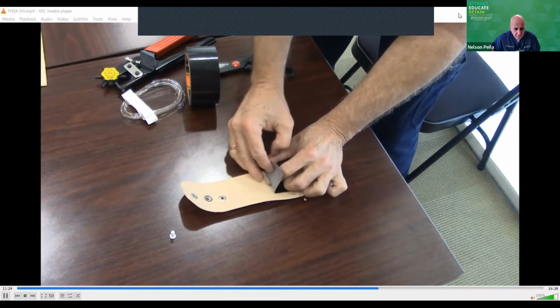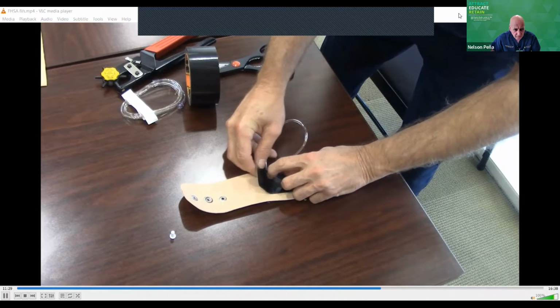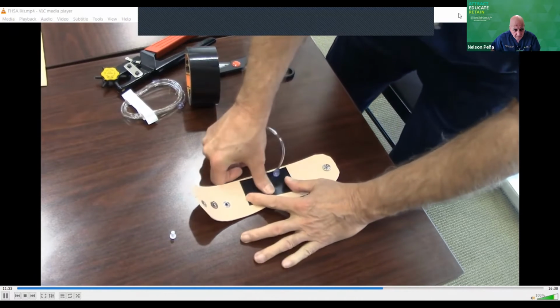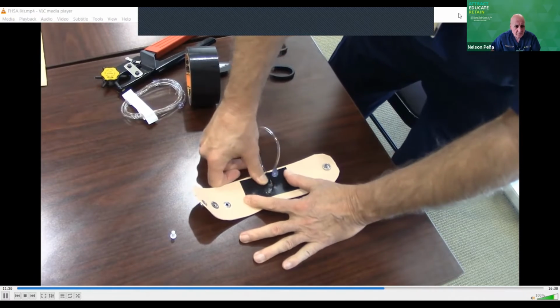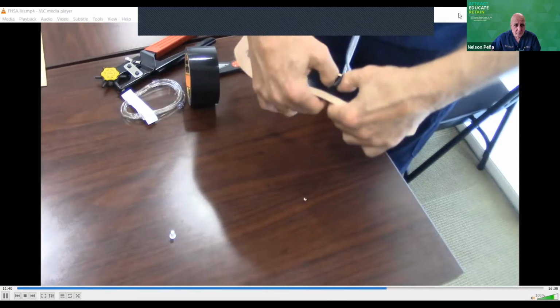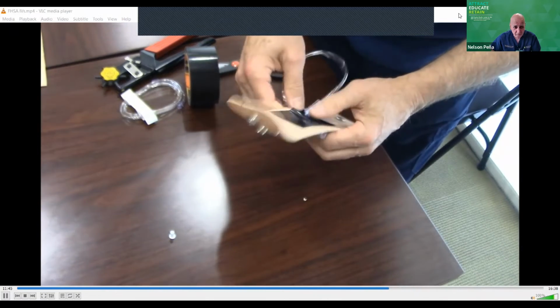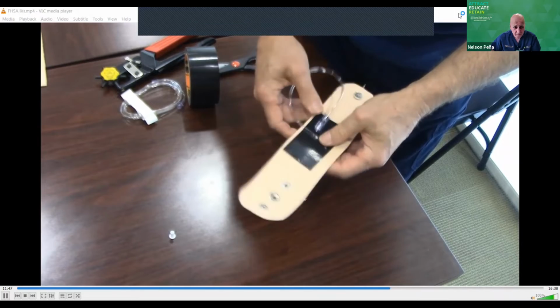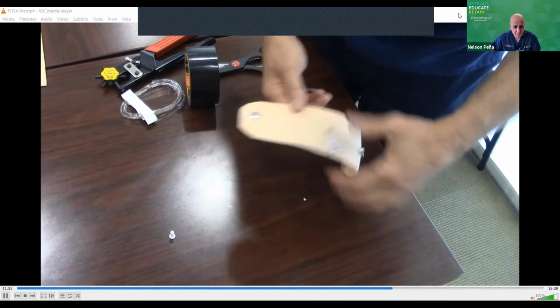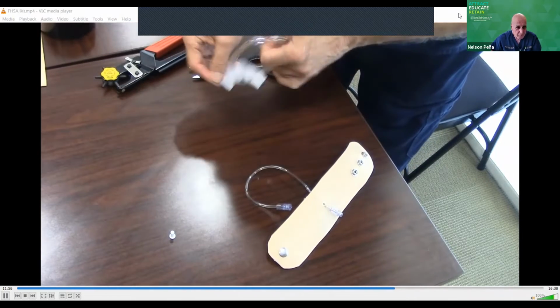Now, put it right up against the tubing, and then bend it up over the top of the tubing so that it supports the tubing real well, and then just finish doing the tape on there. Believe me, when you put this on there, it's going to stay on there and you don't have to worry about it moving anymore. So now we've basically got our IV tubing done. We're going to connect this part to the rest of the tubing.